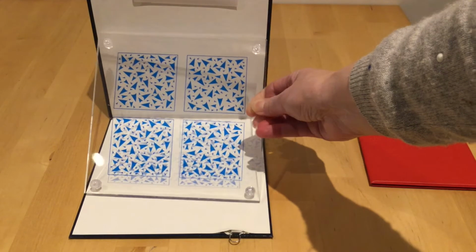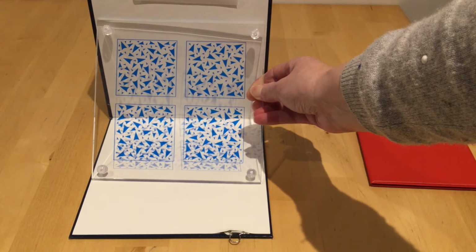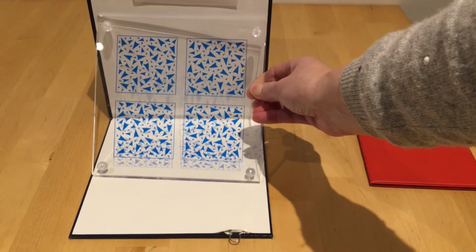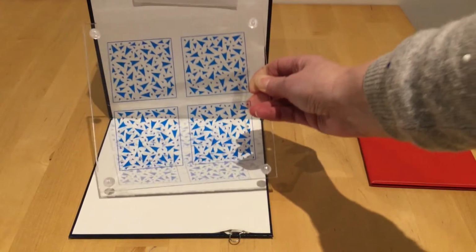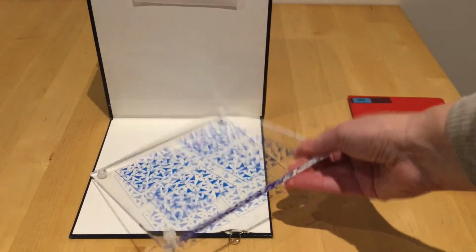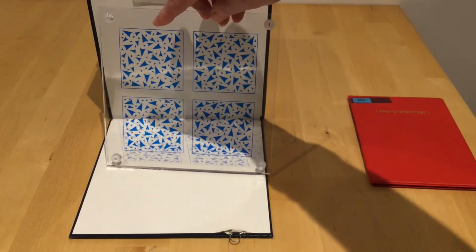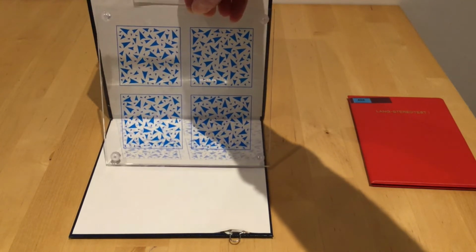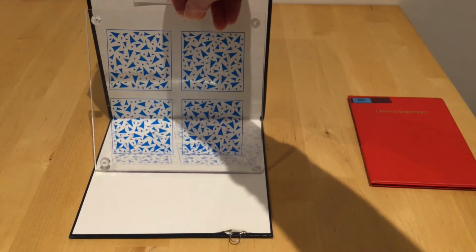If you hold it this way around, again, you probably won't be able to see this. I always hold it against the white background. In one of the squares, there's a circle in the middle, and depending on which way around you hold the plate, the circle is either popping out, which it is at the moment on this top right square in the middle. If you hold it the other way around, on this top left, now the circle is becoming a hole. It's sunken back into the plate, it's not standing out, it's sunk in.